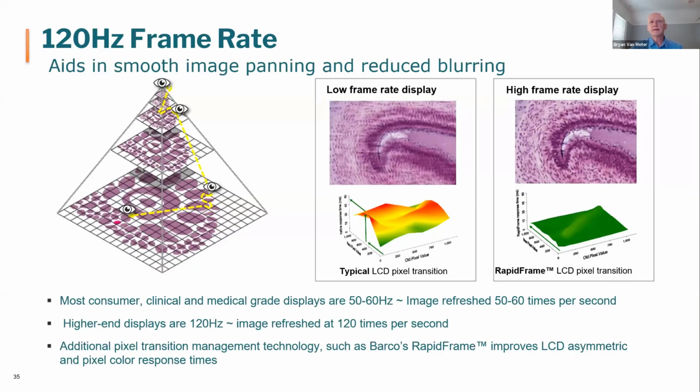Tom talked a little bit about this, the pyramid. You mentioned the pyramid. Basically, it's one big photograph that the digitized information gets put up layer by layer by layer, and you have to navigate across and through that. Because of that, slides and data are brought across the stream very, very fast.